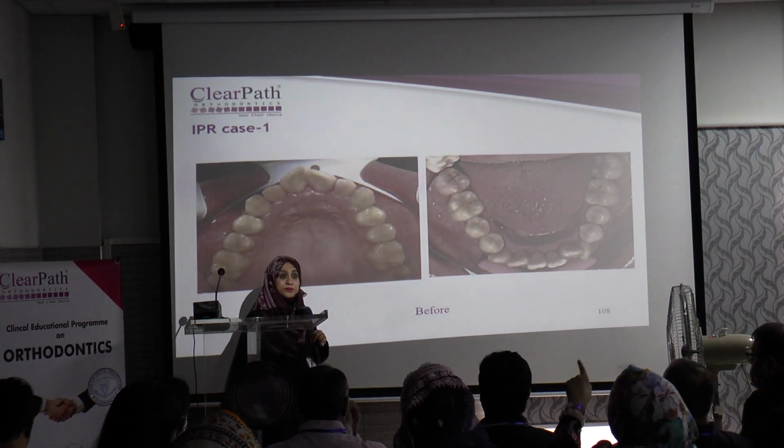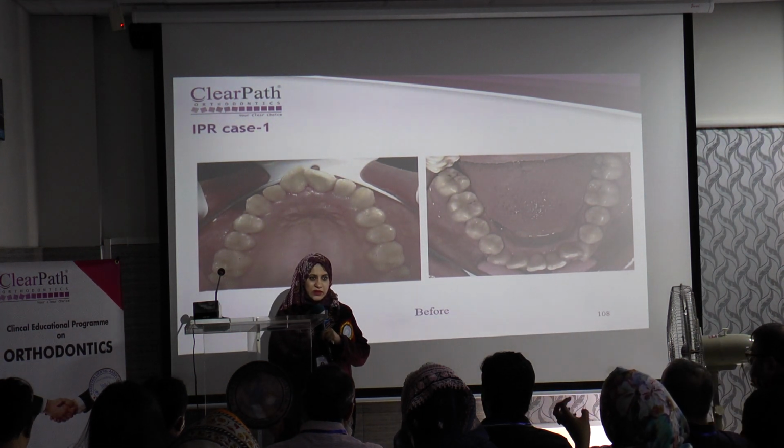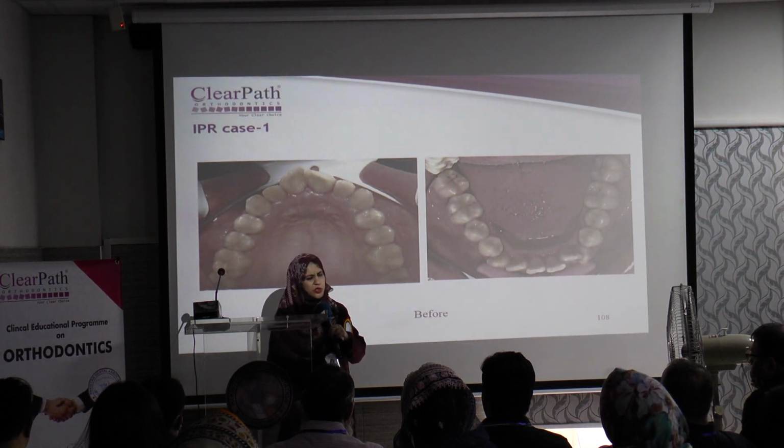So one more thing is space closure. Up to what size of a space can be easily closed with an aligner? 4 to 5 millimeters.